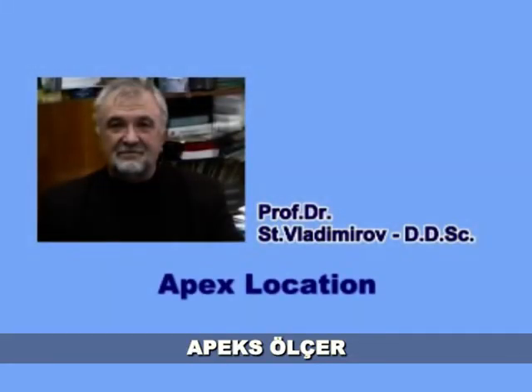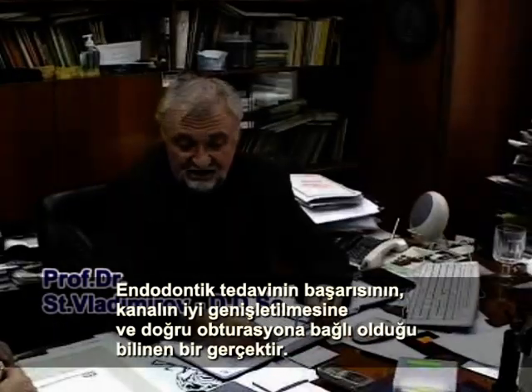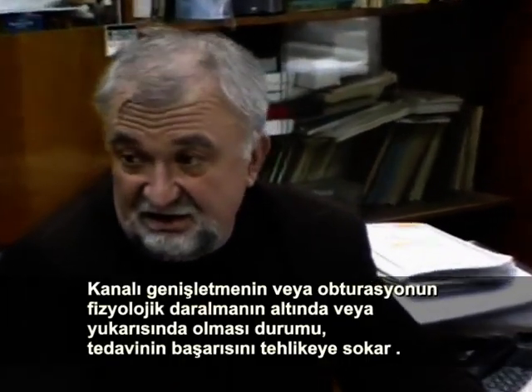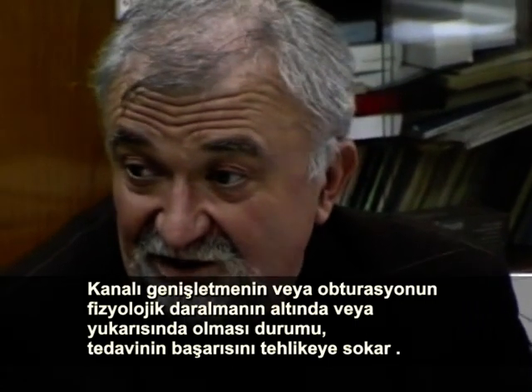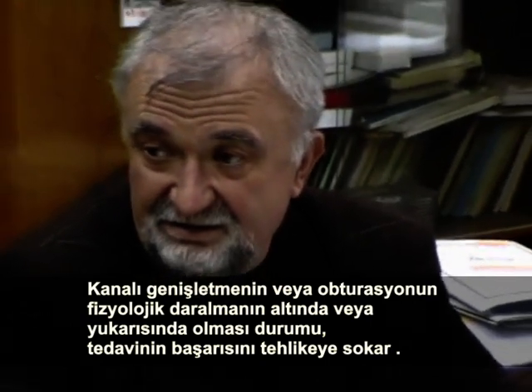Apex location. It is a well-known fact that endodontic treatment success depends on the proper preliminary processing and obturation of root canals. The good result from the treatment is at risk in case of preparation or obturation above or below the physiological constriction.